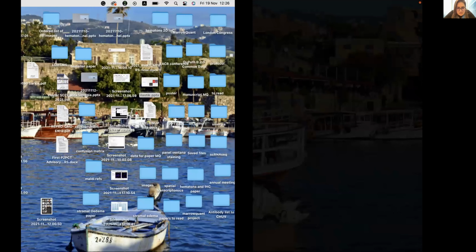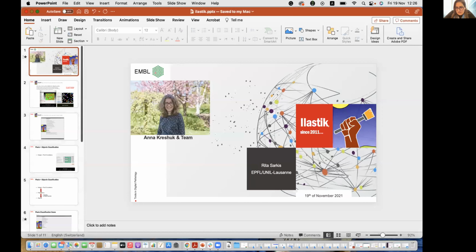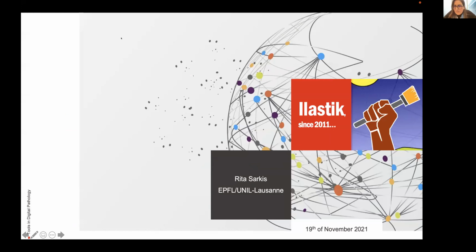Thank you, Cedric. I'm sharing my screen. And okay, can you see it now? Okay, so thank you again, and I will be presenting Ilastik.